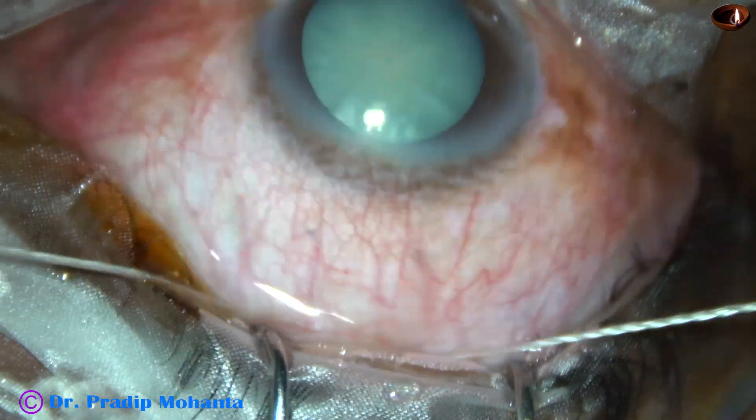I inject the dye in the anterior chamber and then wash it out with adrenaline. Now I am going to inject 2% hydroxypropylmethylcellulose. Whenever the cataract is intumescent, if we want to get a rhexis, we should plan a two-stage rhexis.